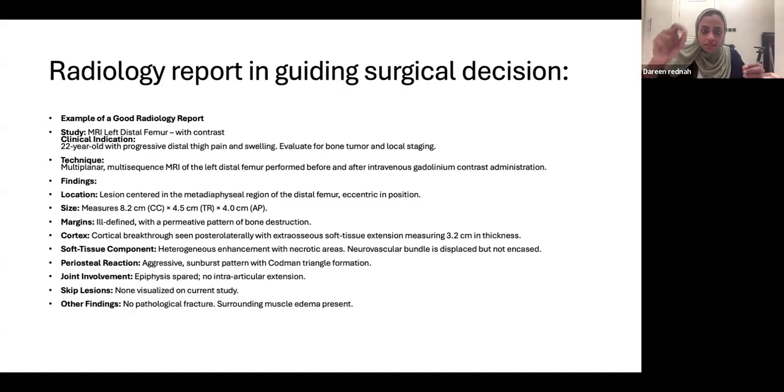So we plan intraoperatively. Sometimes, with an intramedullary tumor, you cannot see outside the bone. You don't expose the bone, you expose the soft tissue, so you approximate what is mentioned in the report. It's 8.2 centimeters, so you approximate this is my resection, then take a margin and send it for pathology. If the measurement is accurate, usually the margin will be free. Then it comments on the margin. It's ill-defined with a permeative pattern of bone destruction.